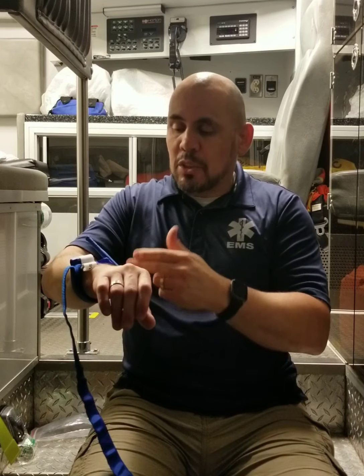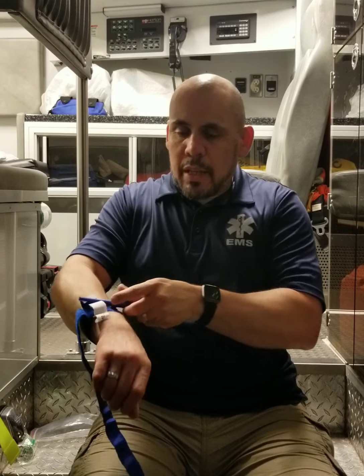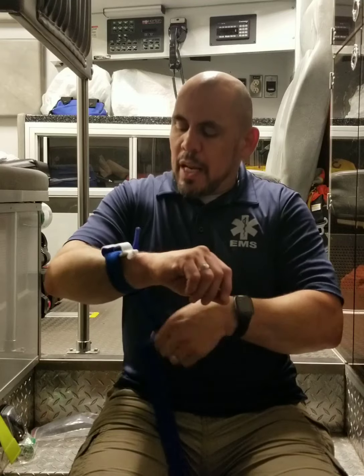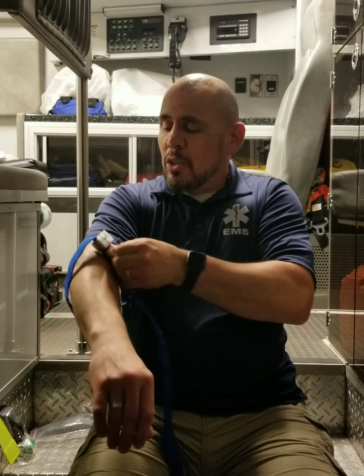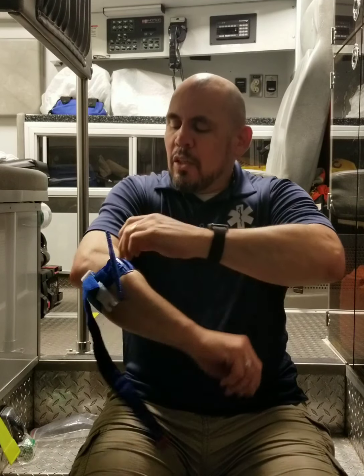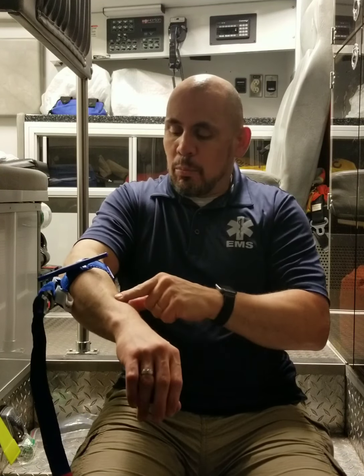And again, it may take a while, because if it's a complete amputation, it's going to take a while. Let's just say that maybe it's just holding a little bit. I want to make sure that the bleeding stops and there's no pulse. Another way of looking at it, let's just say that it's more of a nasty cut. It's just a nasty cut here. So I could go a little bit higher above the elbow or just below it. Same thing. I want to tighten it, turn the windlass. I want to keep turning it until the bleeding stops and I feel no pulse. Again, bleeding stops and there's no pulse.